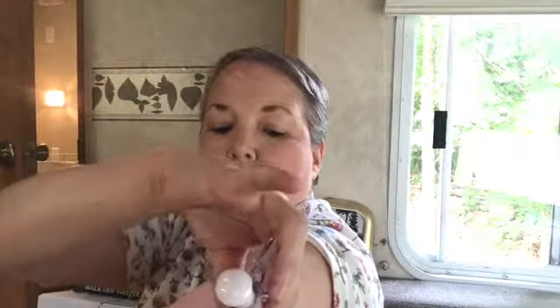So what I'm going to do is place this on the back of my arm. Now I have to be really careful how I place this. I'm going to put my arm over like this, and I'm going to stick it on right there. You see that?